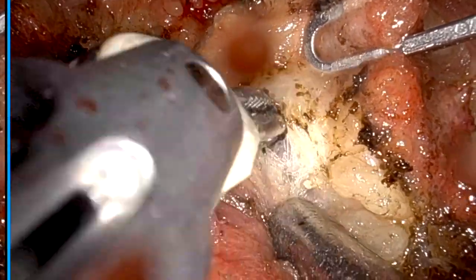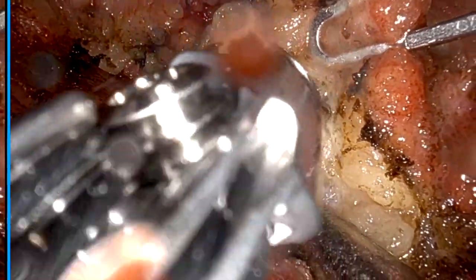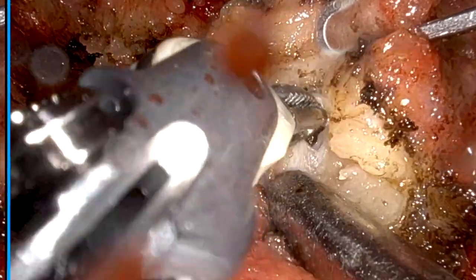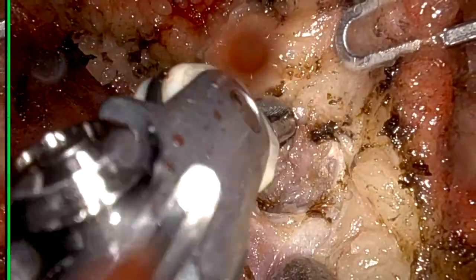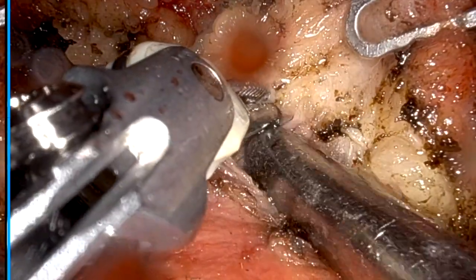If we had chosen bilateral axillobreast or transaxillary approach, we would be bound to put an additional scar at the neck for microvascular anastomosis. So to avoid that additional scar, we chose the retroauricular approach. We will give only one scar which the patient can hide.